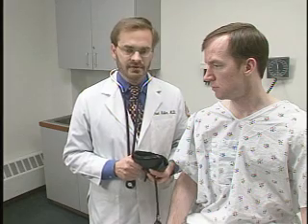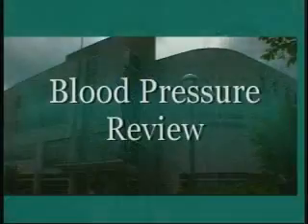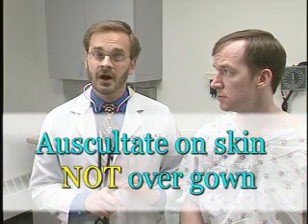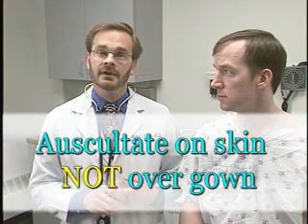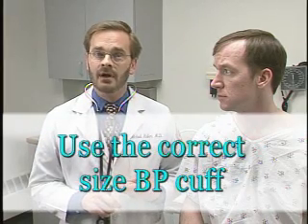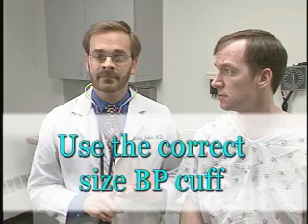And again, it's important to use a right-sized cuff, because if the cuff is too small, it'll falsely elevate the patient's blood pressure, and you may diagnose the patient with high blood pressure, hypertension, incorrectly. So let's finish up with blood pressure by reviewing some of the common errors in assessing blood pressure. First, again, checking the auscultation over an article of clothing or a gown is incorrect. Second, using a cuff that's too small will falsely elevate blood pressure.